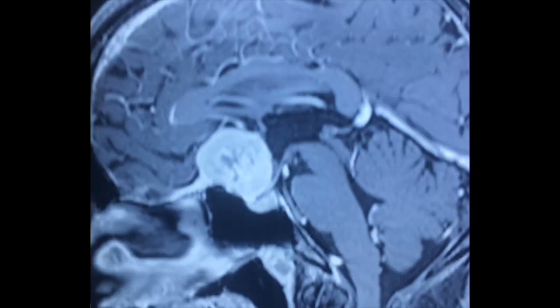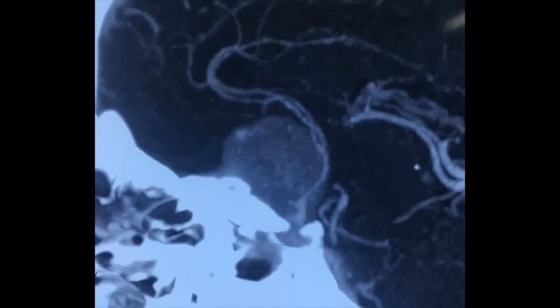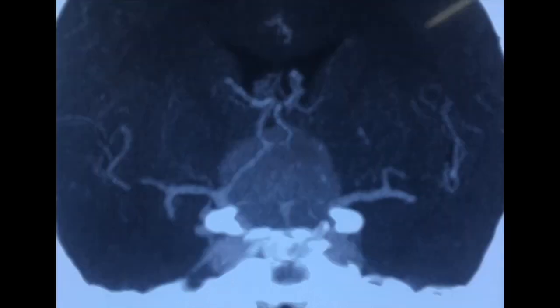Contrast MRI showed a densely enhancing extra-axial mass lesion suggestive of meningioma, of maximum dimension 4 cm, centered on the tuberculum with anterior dural enhancement up to the planum sphenoidale. The tumor base was narrow in the coronal section with no lateral dural tail. In CT angiography, the tumor was very close to the ACOM complex with no encasement of vessels.